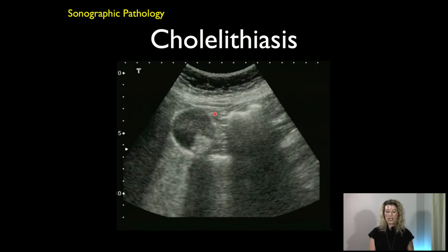So essentially what you're seeing is two things on this slide. The bowel gas is over here on the right side, and the gallbladder with a big stone in it is here on the left side. Because the image isn't moving, the bowel gas appears to have pretty linear shadows, but when the clip starts rolling, you'll see that that is not the case. And if there's no clip following this, the clip's going to be at the end.